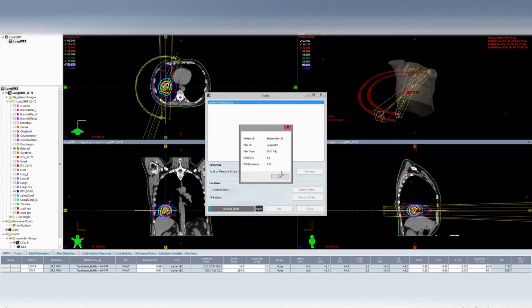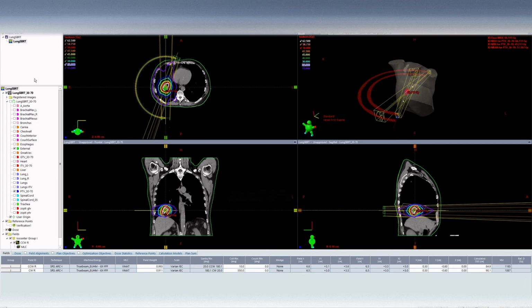But now everything is spaced out evenly, right? So that's good. That's nice. So there you go. If you have something with a single PTV and you always set your PTV as the target volume, then absolutely this would work, right?